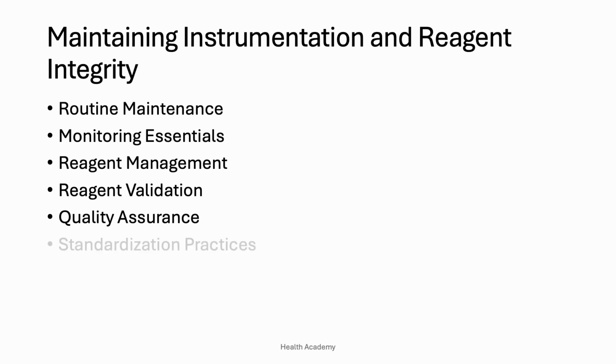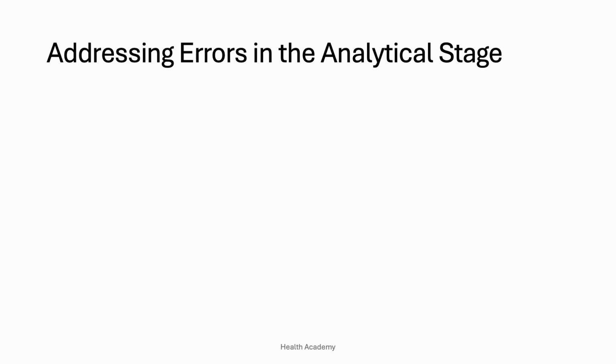sample processing. Standardization practices. Utilize primary standards, which are highly purified substances, to calibrate instruments. Employ secondary standards, which have concentrations determined by analysis and benchmarked against primary standards to ensure precision. Addressing errors in the analytical stage.